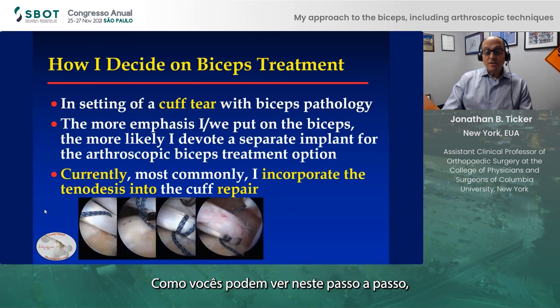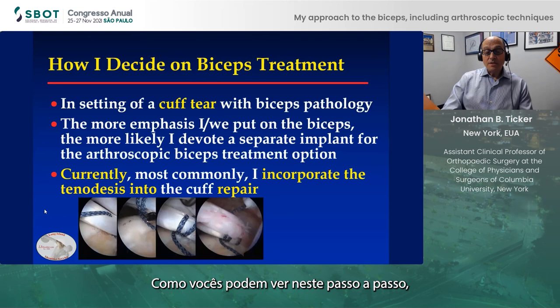As you can see in these steps — bringing it through, around, through, and around the biceps and then into the overlying soft tissue — remove the intraarticular portion and proceed with the remainder of the repair. Thank you very much.